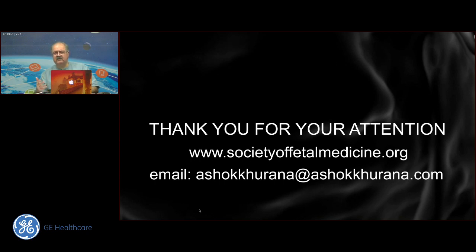The rest of the stuff you will do anyway. You will look at ureters, you will look for kidneys, you look for associated abnormalities, you look at the portal vein, you look at the umbilical cord, you look at the angle that the umbilical vein makes with the rest of the system, the key sign like I said, you will look at the urethra, you will look at the genitalia and so on. But essentially, if you are not sensitive to a bladder that doesn't fill, you're going to miss this diagnosis. It's not a crime to miss this diagnosis. What I usually use is, if I don't see a bladder filling, I always look at the genitalia and make sure that they are not ambiguous, because that's the most common association, that you will often find a very small phallus.